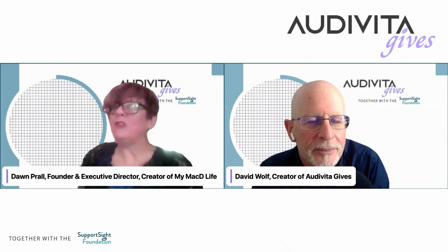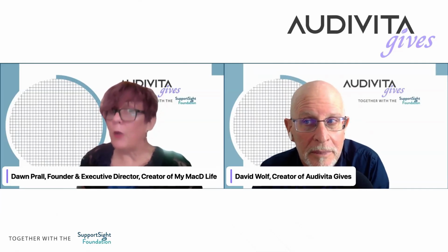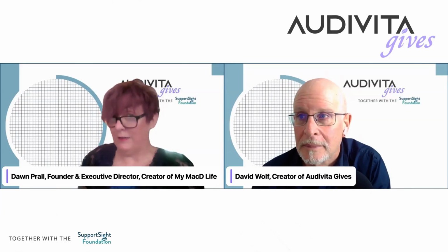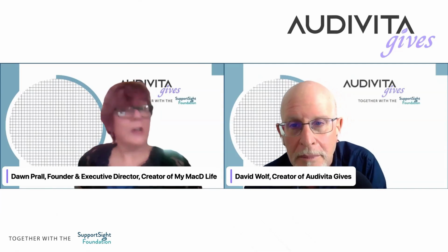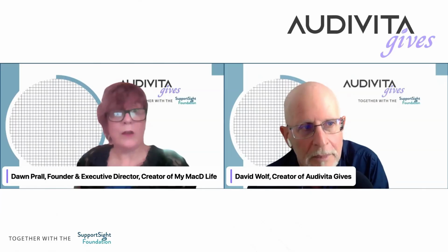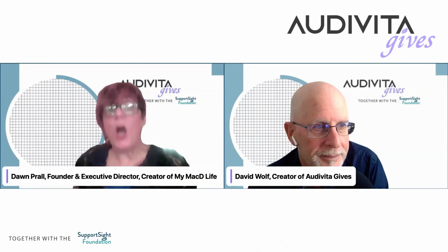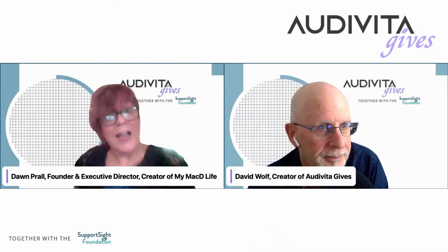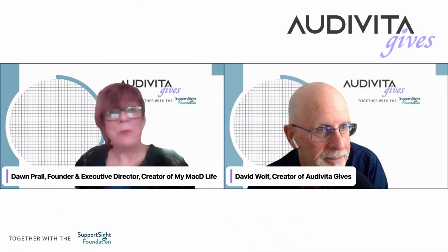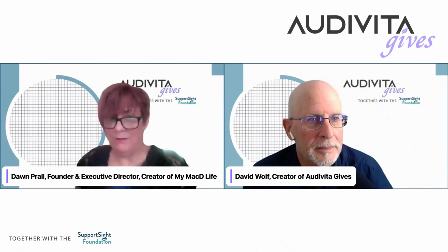And also, here's the thing, folks, that I want to emphasize. The Amsler grid is so significant in your life and so reliable. You are going to know if it's different, especially when you do it every day or regularly. You're going to know that it's not a temporary thing because you have a cold or your sinuses or something. And it is the only way that your eye doctor, your retina doc, your ophthalmologist, anybody is going to know. And please do not wait in between annual exams.